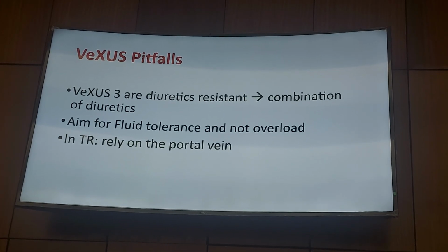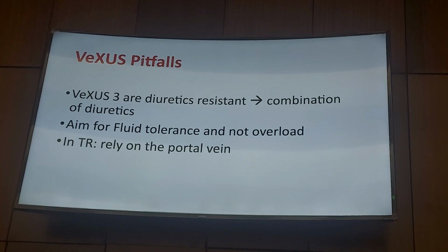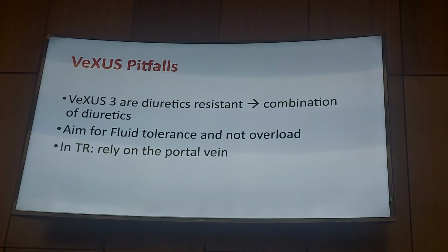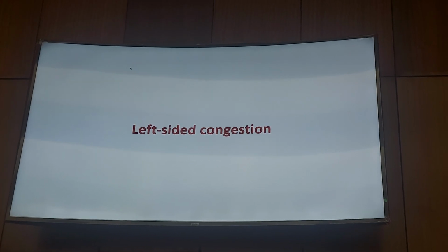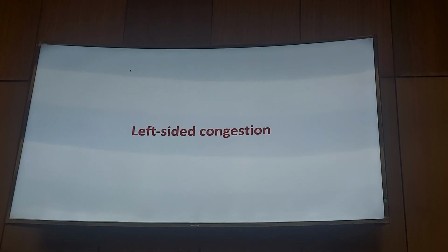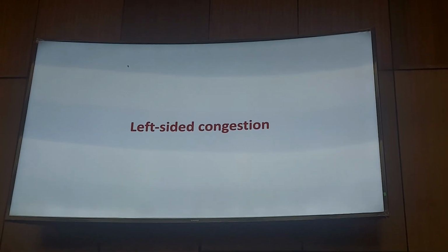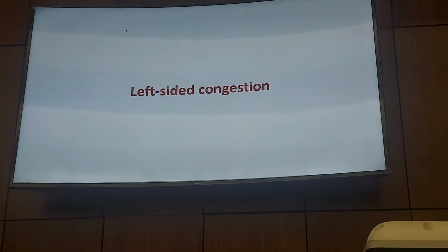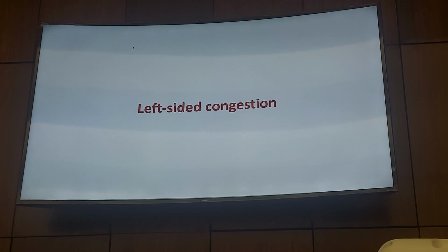Our aim is to stop giving fluids before the harm develops, even if the stroke volume will increase. And that is the target, to aim to achieve the fluid tolerance part. And that is the whole concept of right ventricular assessment and right ventricular preload. I will finish with a smaller part, then we can do the hands-on, but maybe before that I can take any questions if you have any.